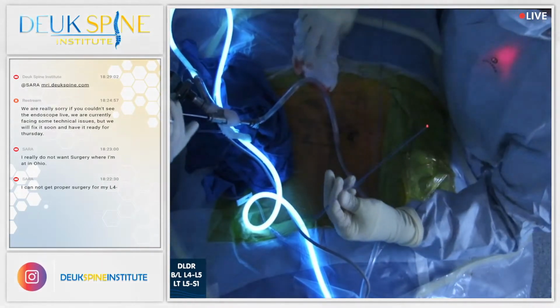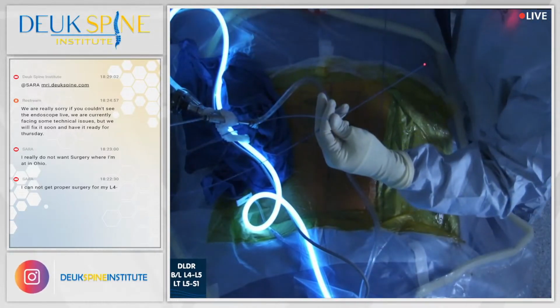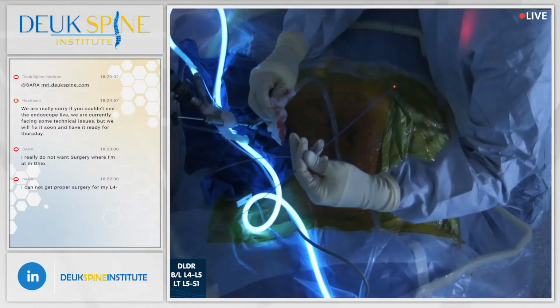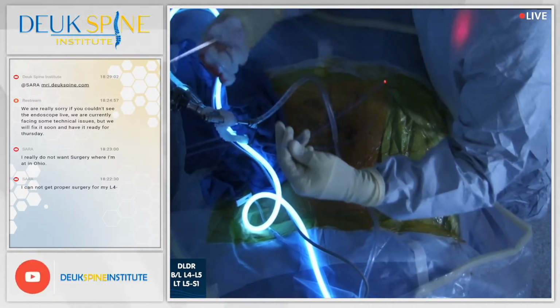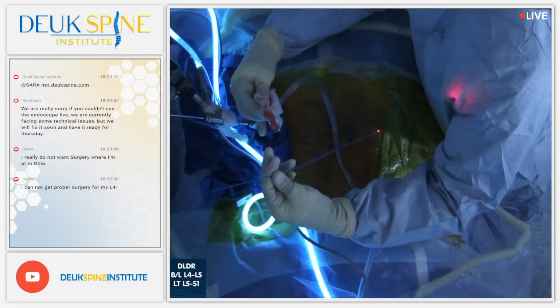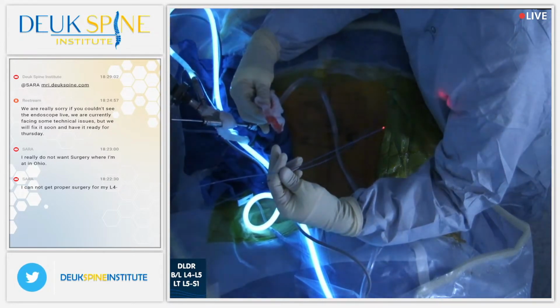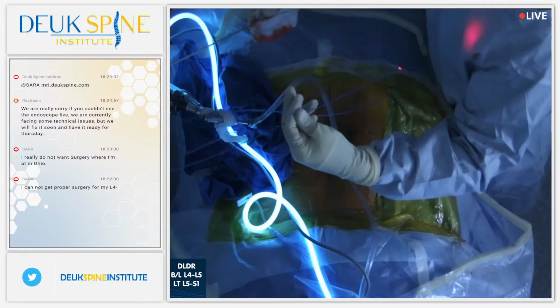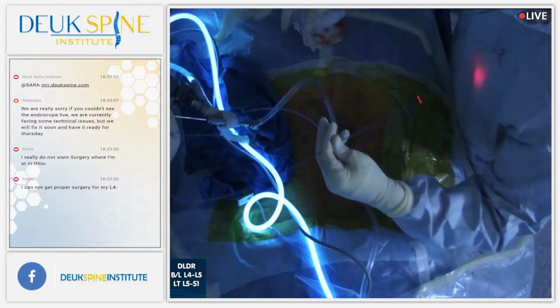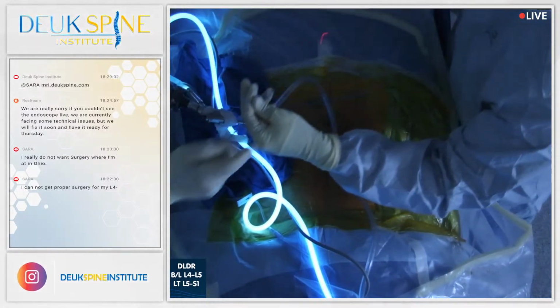Jordan, can I help? What is he looking for? Staples. No, no, staples. I think we can. At one point we'll have to strip it before the next case with it. Oh, this one? Yeah.